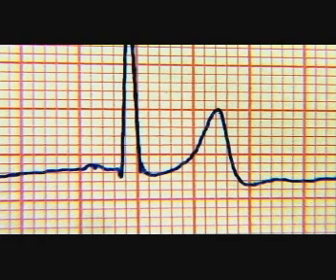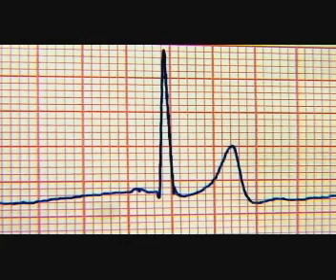When clients present with cardiac symptoms, an EKG is done first as a standard screening procedure. Electrocardiography creates a set of printed tracings, one for each lead, that reflect the client's cardiac electrical activity. ECG graph paper is divided into large and small squares. Each large square contains 25 small squares. The horizontal squares represent time, and the vertical squares represent the voltage of the electrical impulses. The small squares each represent 0.04 seconds, so moving horizontally, one large square equals 0.20 seconds.